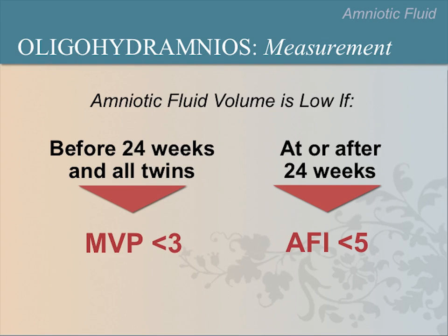There are two ways to measure oligohydramnios — use only one method, not both. Before 24 weeks of gestation, measure the maximum vertical pocket; also use this method if there are twins. At 24 weeks and later, measure the amniotic fluid index. An MVP less than 3 cm or an AFI less than 5 cm indicates oligohydramnios. Here are more examples of oligohydramnios — notice how these fetuses are harder to see because there is no surrounding fluid.